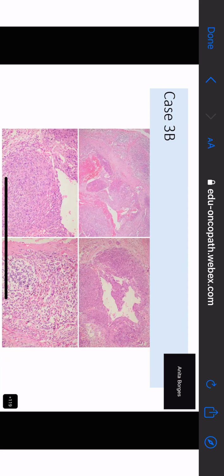What about Vimi? What did you say, Vimi? Vimi is unable to unmute herself. Ma'am, I thought it was a kaposiform hemangioendothelioma. You also thought it was hemangioendothelioma. Limpy? Ma'am, epithelioid hemangioma. Okay. Who else is there? Suvaita. Ma'am, I thought it was epithelioid hemangioma.